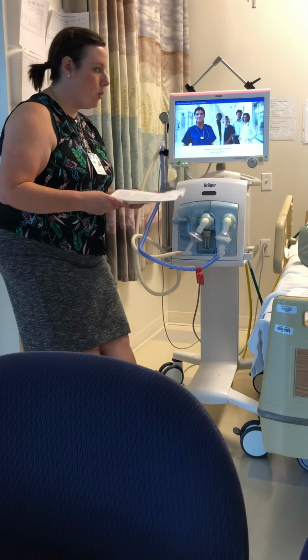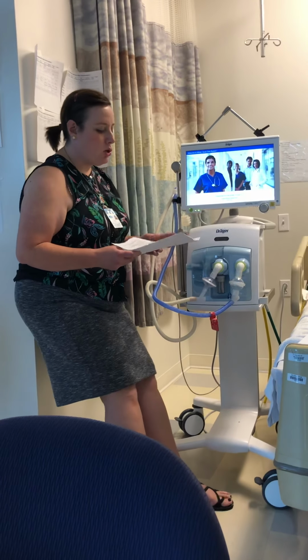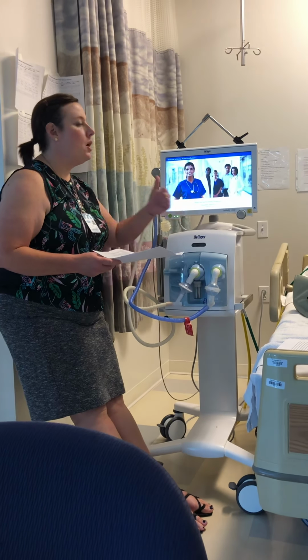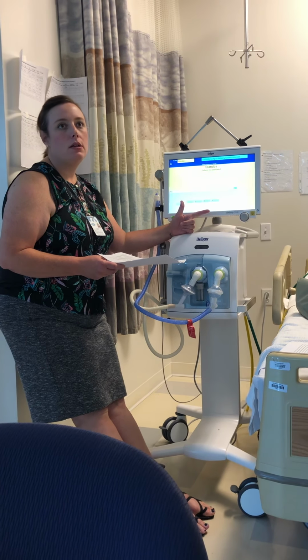So the Neo CPAP setup. You verify physician order for appropriateness. All of those things that we talked about as indications or contraindications for a nasal CPAP. So CO2 higher than what? 60. pH less than what? 7.25.